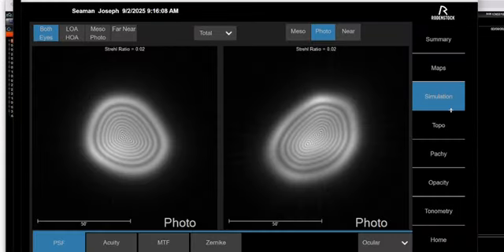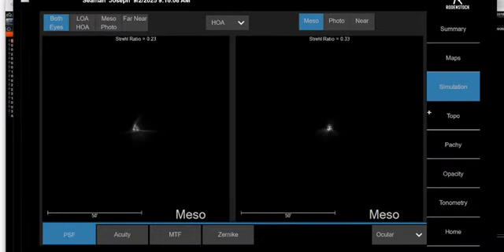The next bit of data I'm showing you comes from our DNI scanner, and this represents how out of focus my eyes are. I'm short-sighted. We should just see a dot of light here. These wide circles show a measurement of the focus, or lack of it in my case, of my eyes. We've then got higher order aberrations measured. This is measuring scatter that especially affects you at night, and this is why people don't like driving at night. For me, I've got a fair few higher order aberrations. These are the blur left over even after I'm wearing my glasses.